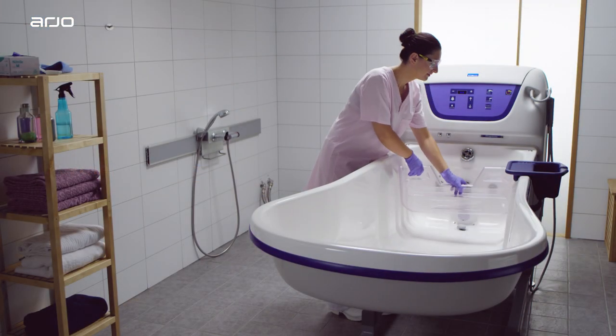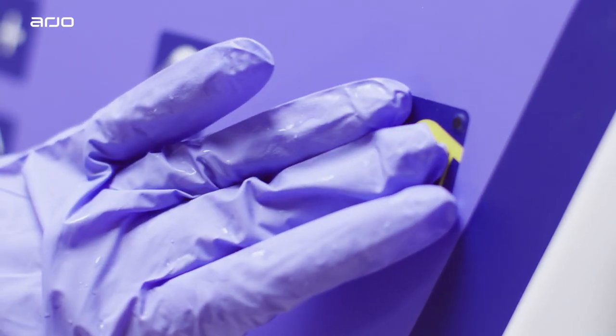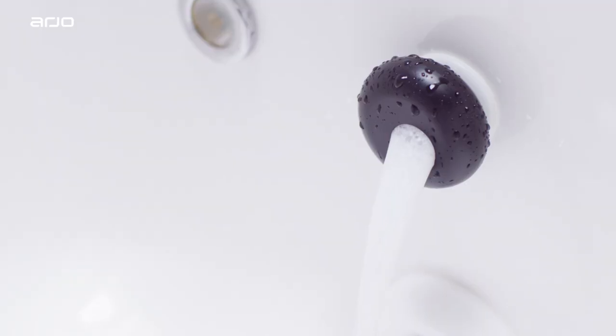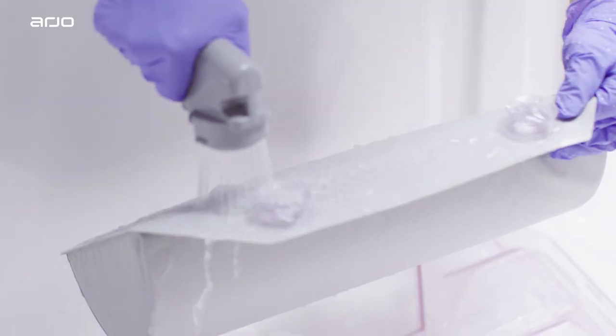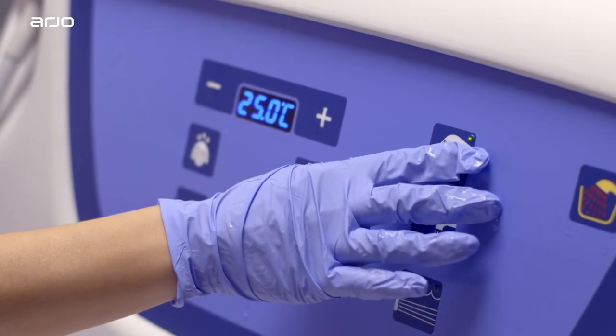For further guidance when using the Rhapsody bath, please see the additional guidance videos. In the event of questions at any point in the bathing or disinfection cycle, please consult the Rhapsody user manual or your Arjo sales representative.